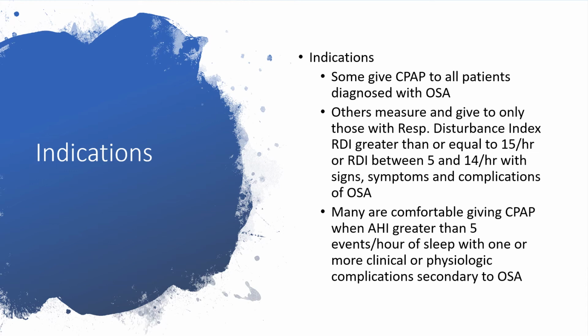But if it is disturbing the life of the affected patient, and they couldn't sleep, because I know the complications of lack of good sleep, or daytime sleepiness is disturbing the productivity of the person, and the person is even prone to road traffic accident, why not give the CPAP? So it's controversial, sort of. But in all, the safety, productivity, and well-being of the patient will be more important than all these parameters.